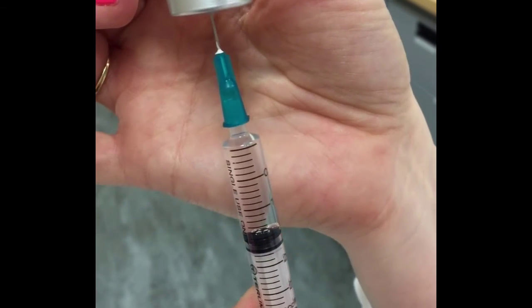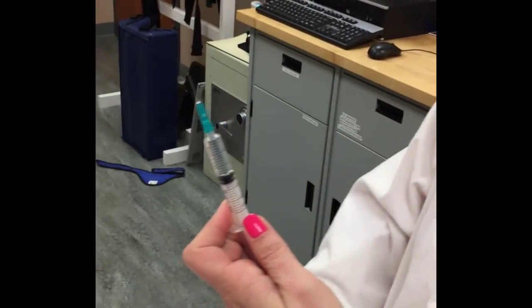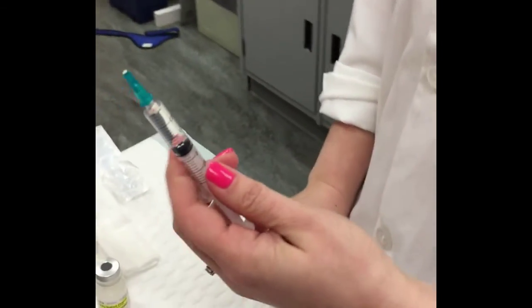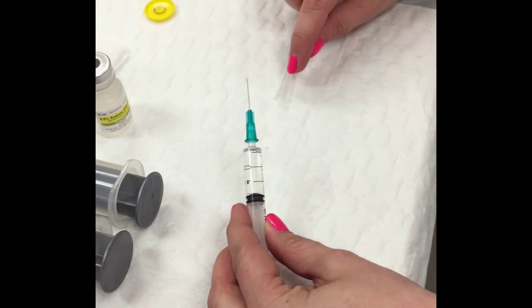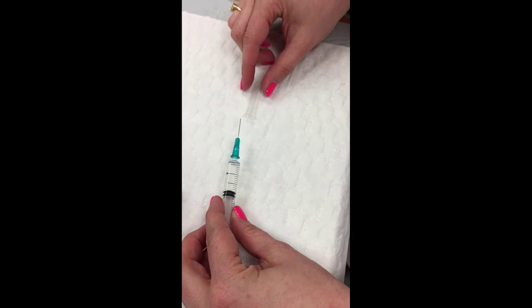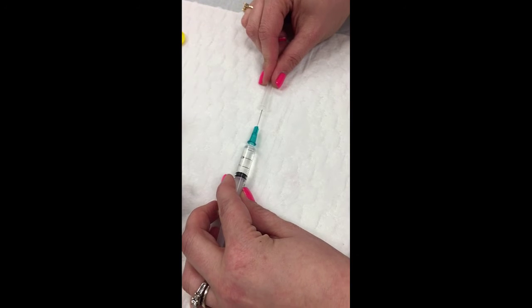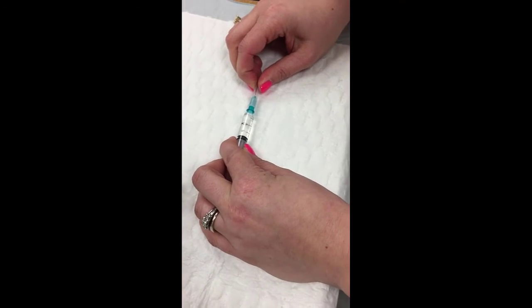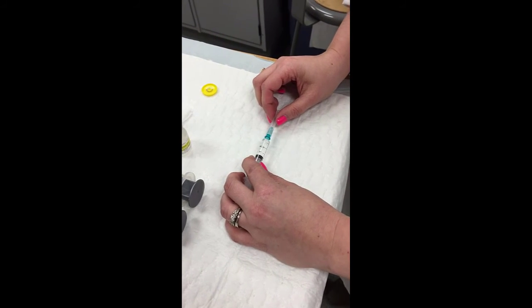And now I am going to remove my needle from the injection medication bottle. And now I need to recap my needle, and it's very important to do that safely. So what I'm going to do is I have the lid of the cap for my needle. I'm going to leave it on the table and hold it gently, and I'm going to now slide my needle into there. It's very important to do it this way, so that way you don't risk a needle stick injury.